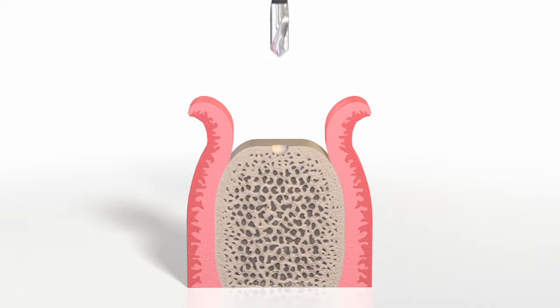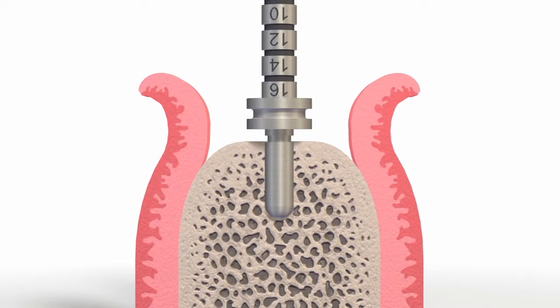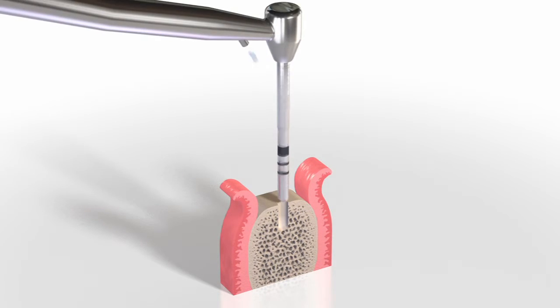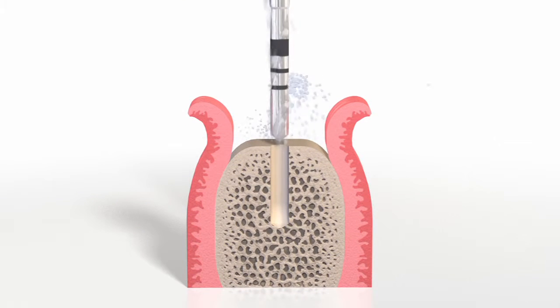The implant axis is marked with the 2.2 millimeter pilot drill to a depth of about 6 millimeters. The short side of the 2.8 millimeter depth gauge is inserted with the distance indicator to check for correct implant axis orientation. The implant bed is pre-drilled to the final preparation depth with the 2.2 millimeter pilot drill.